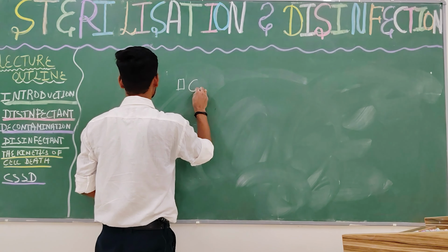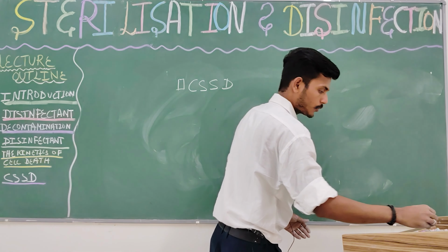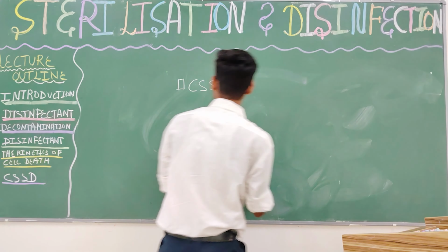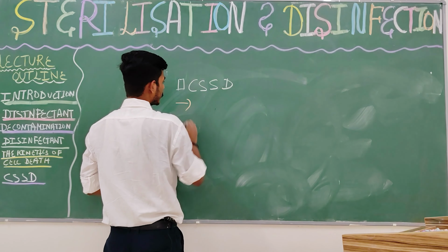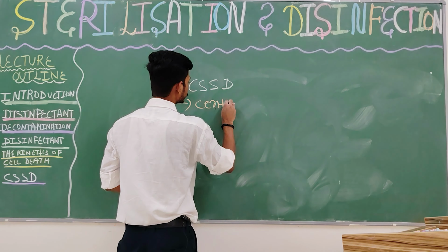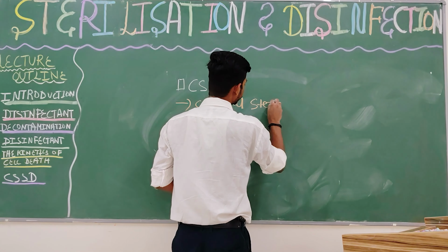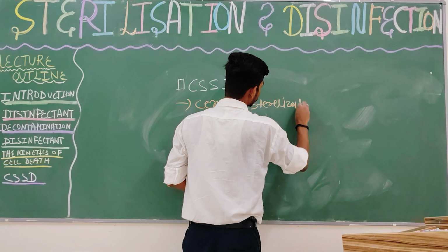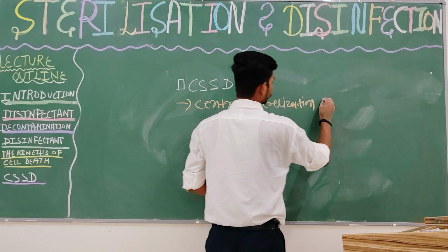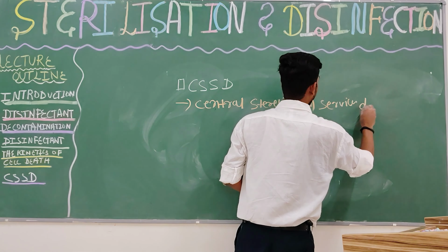CSSD. You should write the full name of the CSSD. CSSD stands for Central Sterilization Service Department.